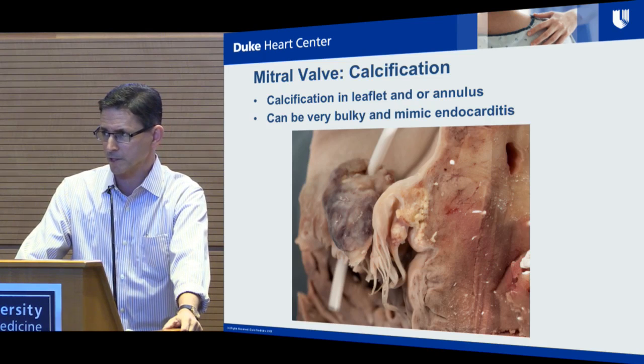This is also going to be a challenge with deployment, just like we saw in the aortic side.